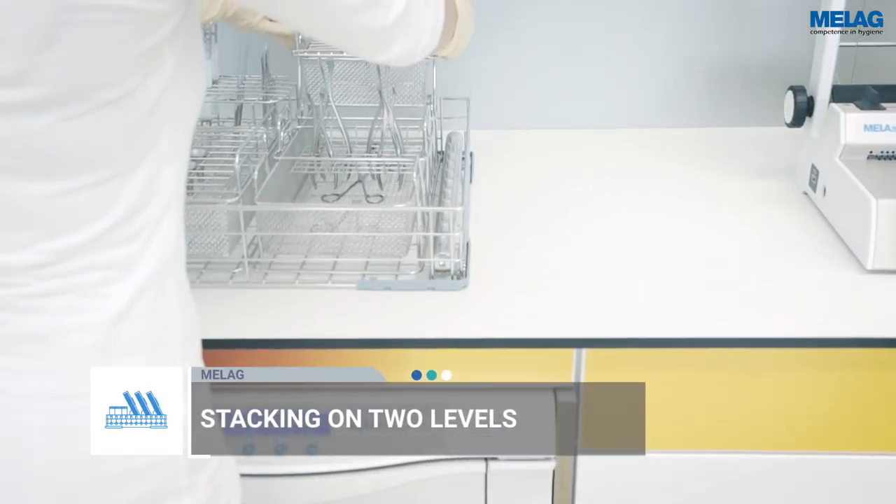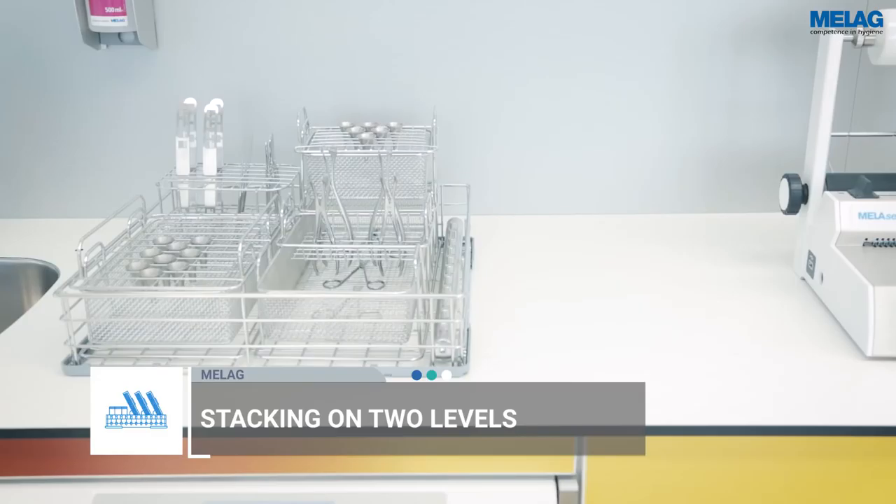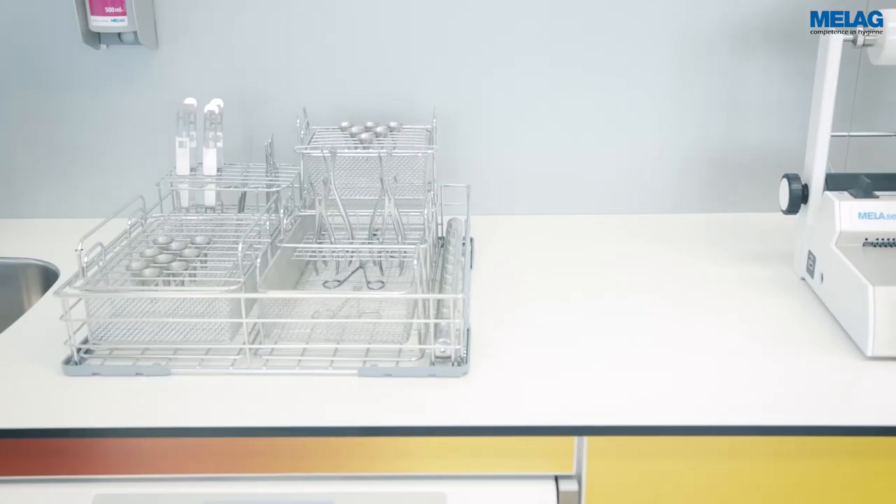Stacking the flex baskets on two levels enables efficient use of the practice-optimized treatment chamber of the Milotherm 10.